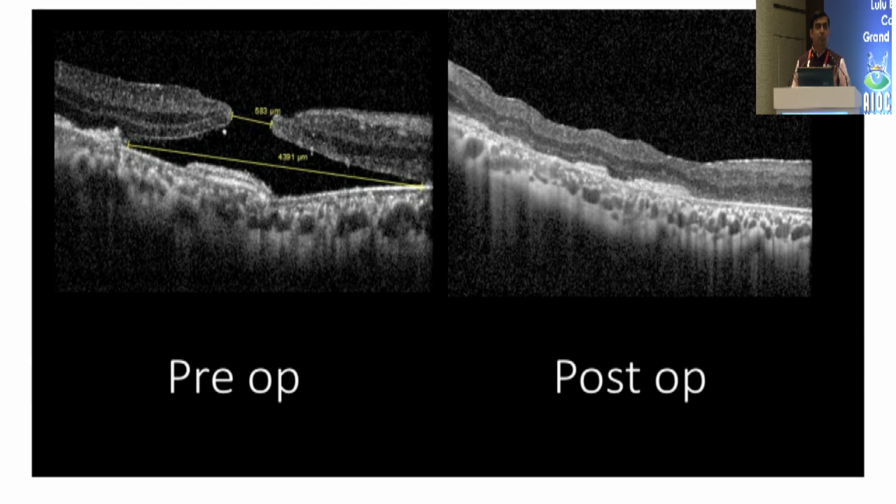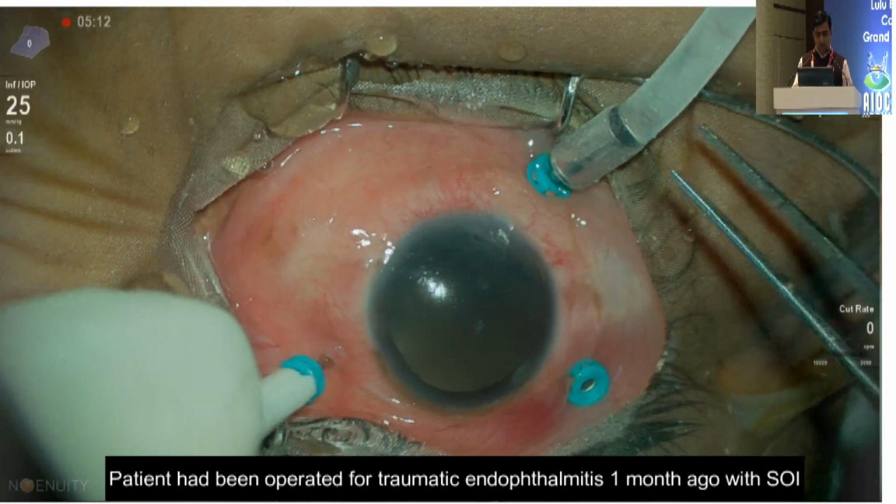So we have to be careful, especially in a traumatic subretinal hemorrhage, when injecting TPA, as there is a possibility that the patient might have a MAC hole as well. It's best indicated in cases of CNVM or PCV, where we don't have this doubt, whether the trauma itself could have caused the MAC hole, or doing a subretinal TPA injection also causes it. So it's always better to be as safe as possible.